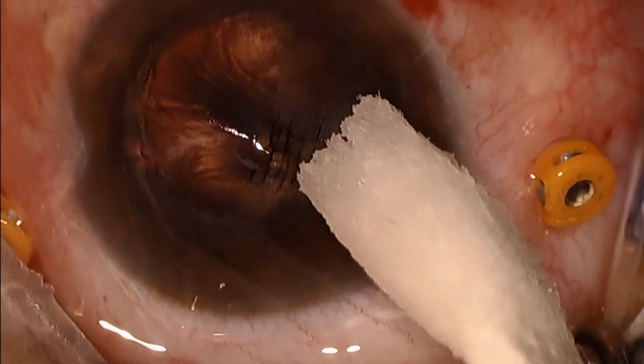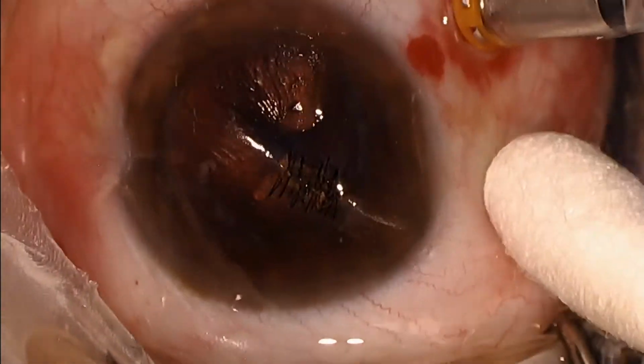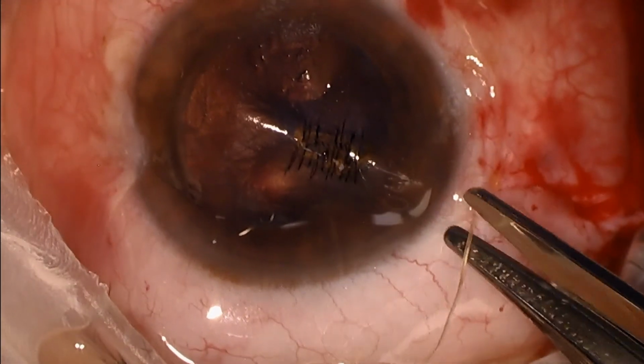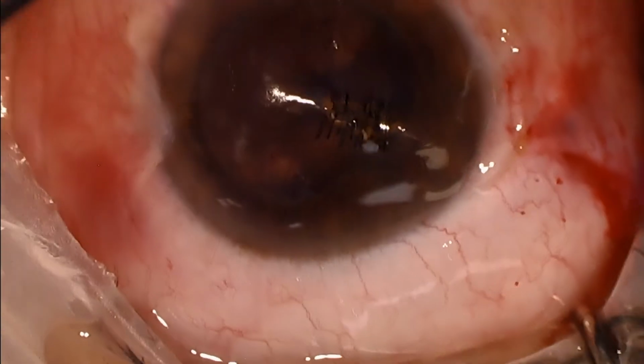So prior to surgery, this patient's vision was light perception, as you would expect. You can see still it's not quite closed, but now as we're closing up the rest of the eye, we can check the pressure, and it was in fact holding pressure on normal palpation.